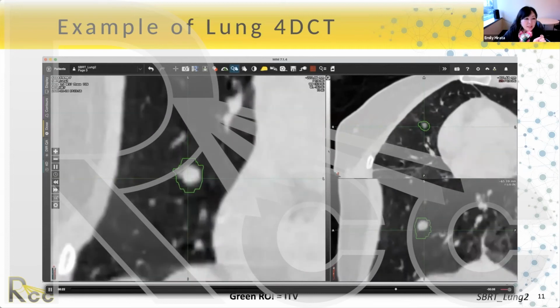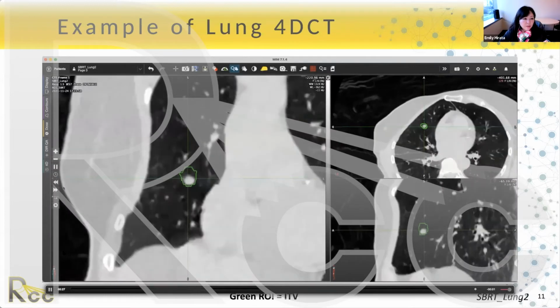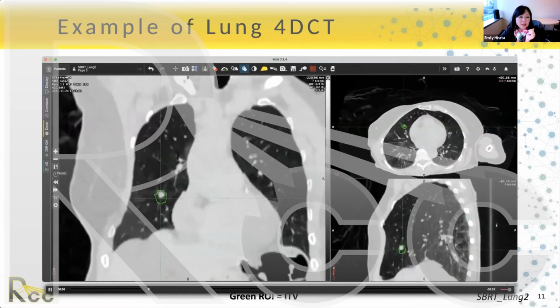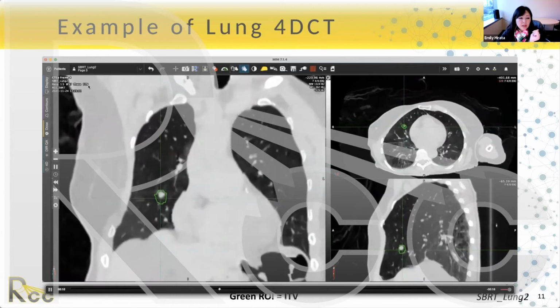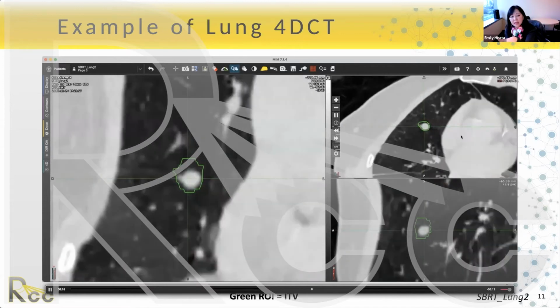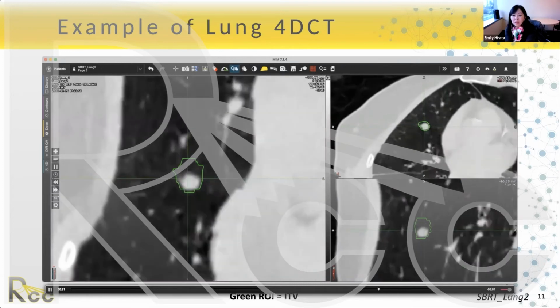So it's hard to see, but if you look at the upper left, it says frame 1. Play it through. It's going through different frames. The video is a little bit choppy. I apologize for that. But you can see how it's jumping through the different phases. So it's a composite of all of the phase data and looping through it to create this seemingly movie loop.